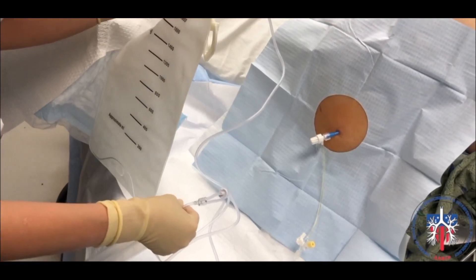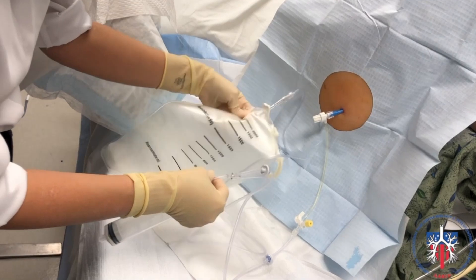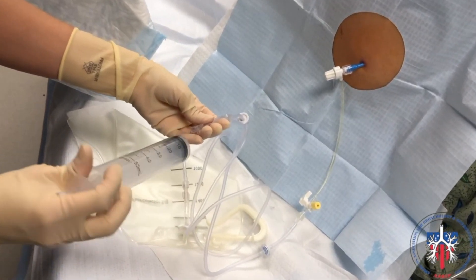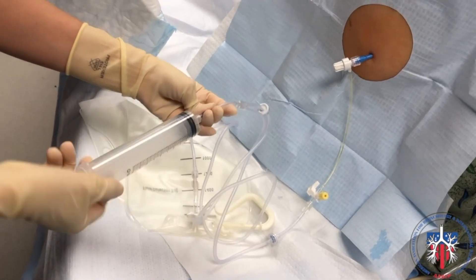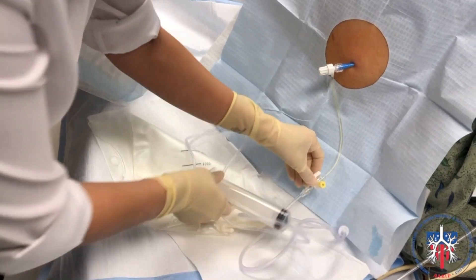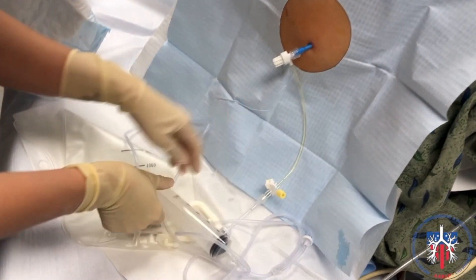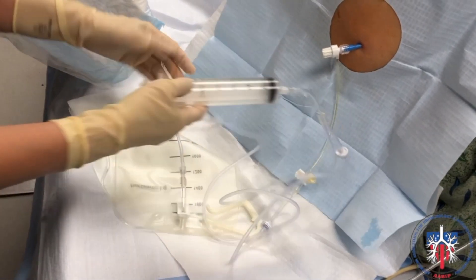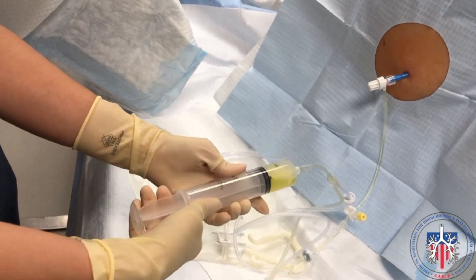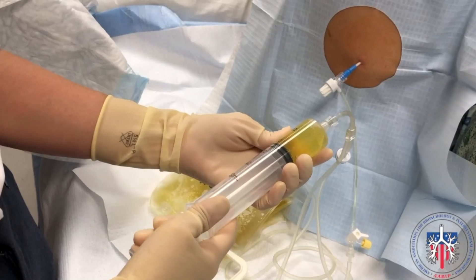To drain the fluid manually through the universal drainage set, attach the shorter length of tubing to the remote stopcock, then attach the longer length of tubing to the drainage bag and a 60 cc syringe to the wide connection of the tubing set. Open the stopcock toward the yellow knob and start pulling fluid with the syringe. Then empty it into the drainage bag, repeating these steps until the outflow stops.